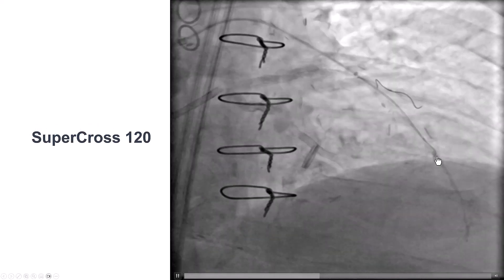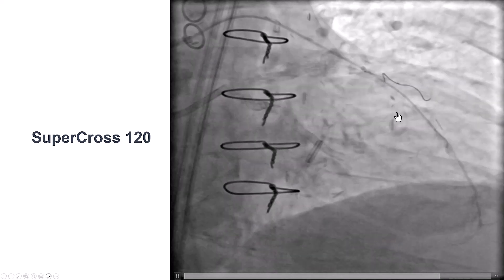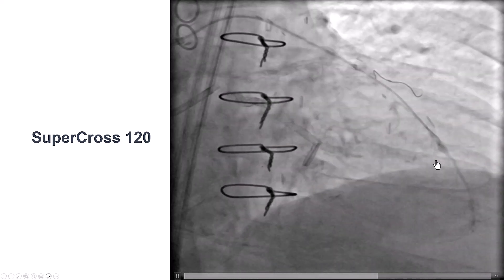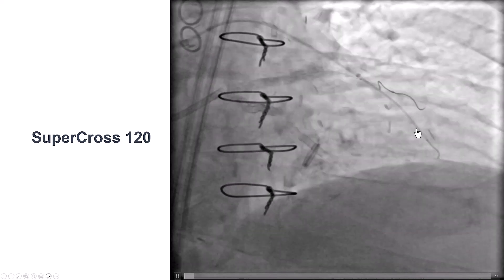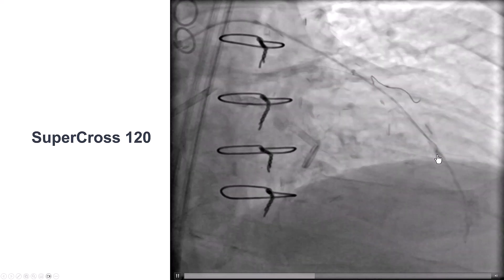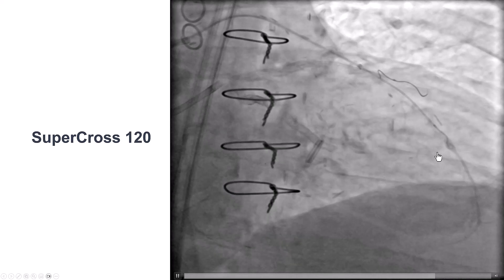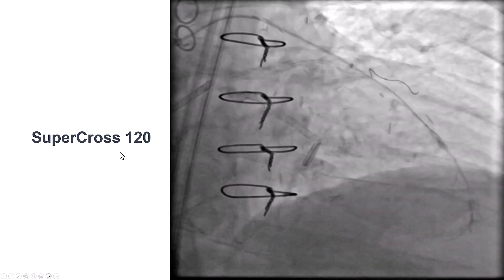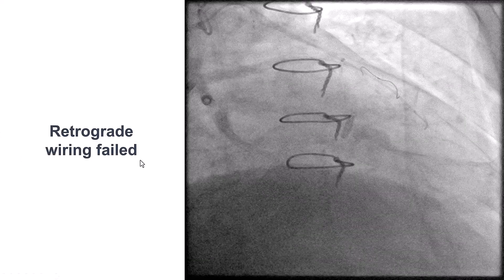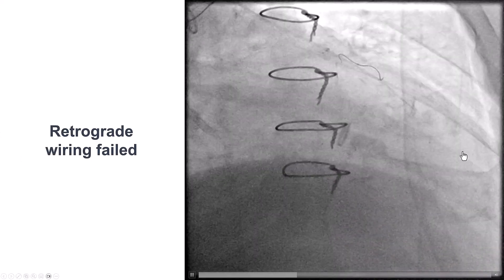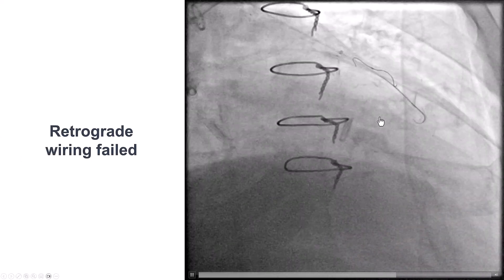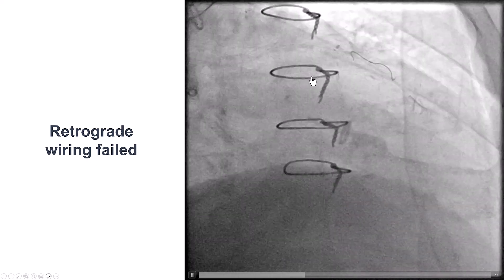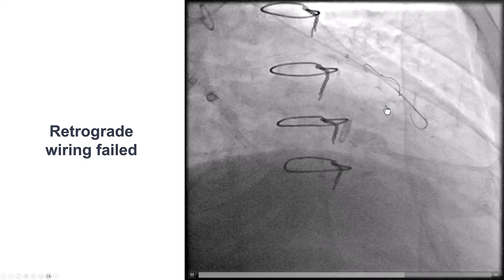We then wanted to go retrograde into the LAD, so we used an angulated microcatheter — a Supercross 120 — that, once inserted into the coronary artery, becomes actually less angulated, so here it was less than 90 degrees. We tried to go retrograde with different wires, including Workhorse as well as Confianza-on-Black, but we were unable to advance them far back enough.